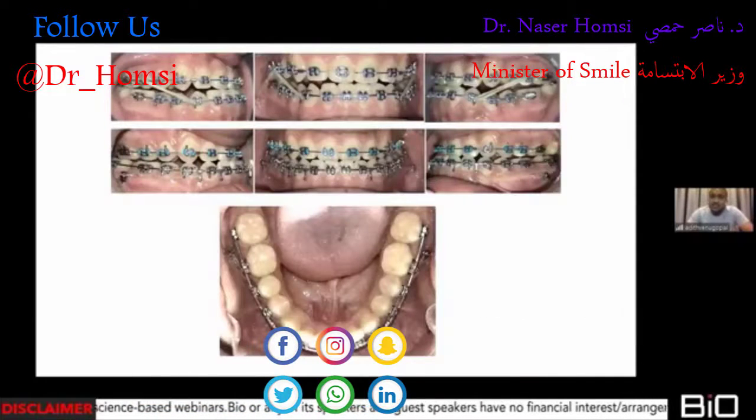And what I did is I placed bite blocks on the lower anteriors because I didn't want them to extrude. But I wanted this particular segment over here to come up. And so that's exactly what happened. Now, in a low angle, I want this part to come up. And so I started using elastics in a distal fashion. And you can see that the curve is flattened.